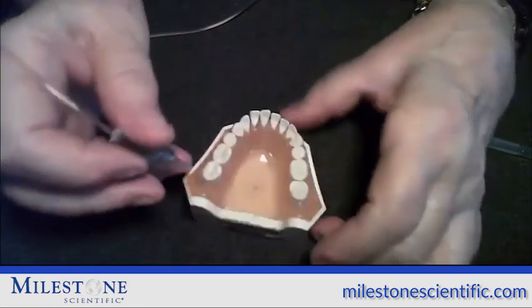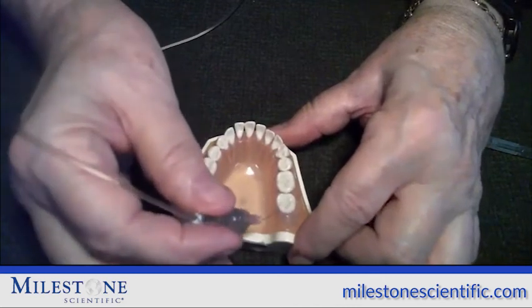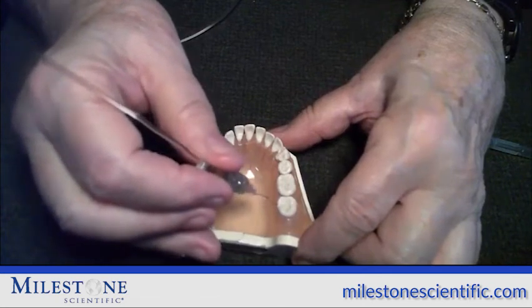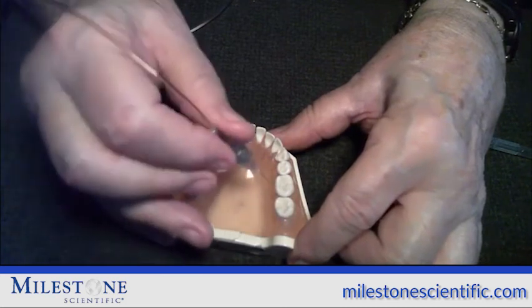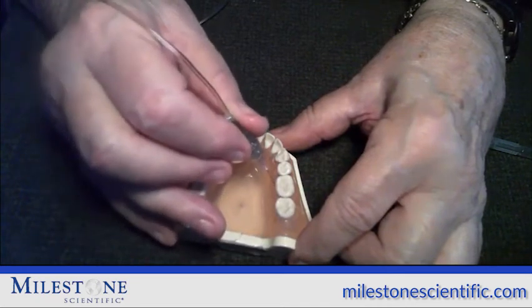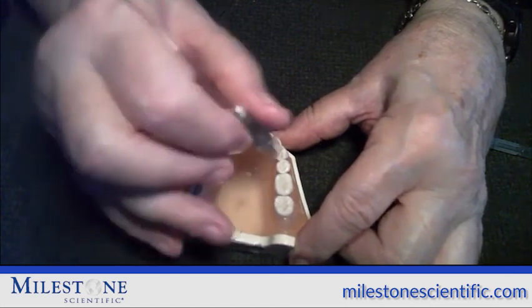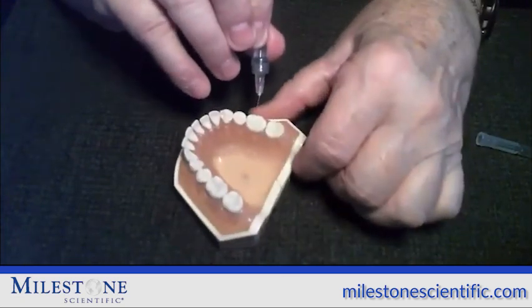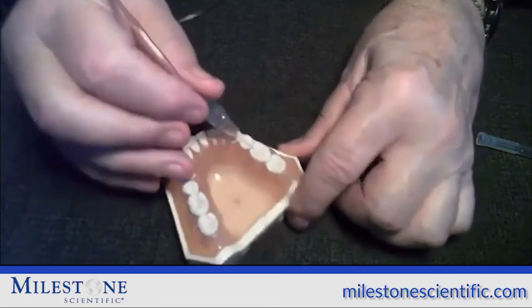What about if you wanted to anesthetize 2 molars next to each other? If you anesthetize the distal of the second molar, the mesial of the second molar, then skip the distal of the first molar. Do not double dose that area. Go to the mesial of the first molar. Okay, again, at a 45-degree angle with bevel towards the tooth. Now you've anesthetized 2 teeth. And then I would also suggest delivering another 1/4 of a cartridge onto the buccal bifurcation of that lower first molar. That should numb up 2 teeth.